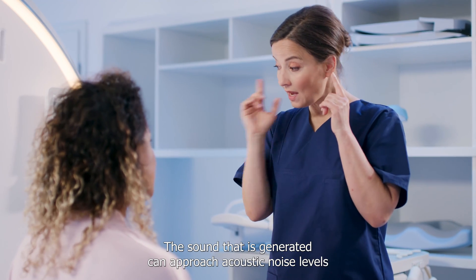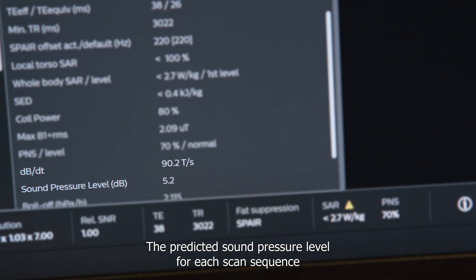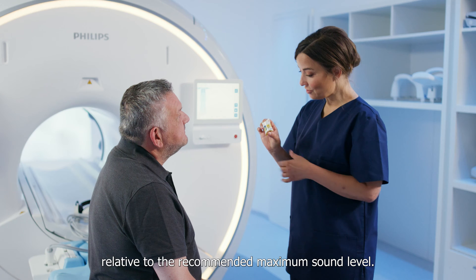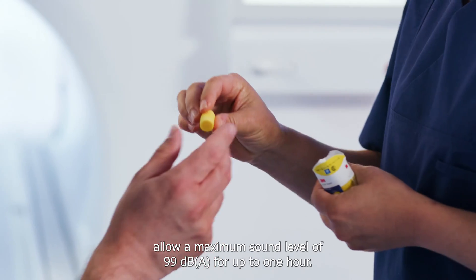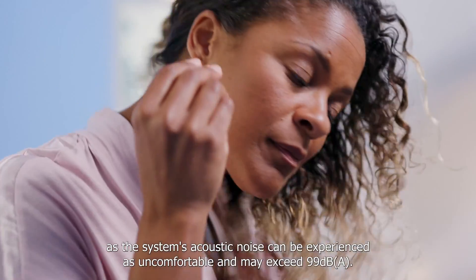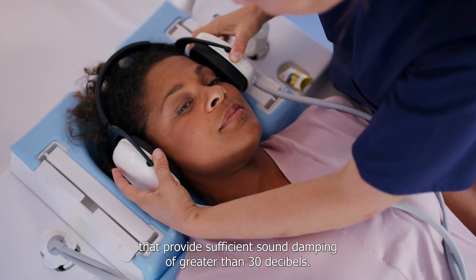The sound generated can approach acoustic noise levels high enough to cause discomfort, tinnitus, or hearing damage. The predicted sound pressure level for each scan sequence is displayed in the user interface, showing the number of dB relative to the recommended maximum sound level. International MRI safety standards for patients allow a maximum sound level of 99 dB(A) for up to one hour. Hearing protection must be worn by the patient during scanning, and must include appropriately fitted earplugs that provide sufficient sound damping of greater than 30 dB.